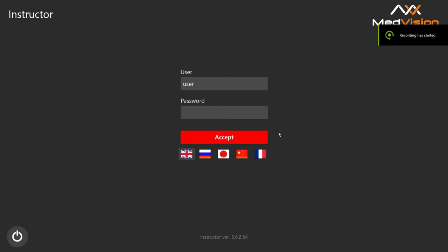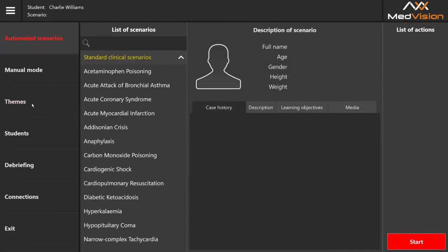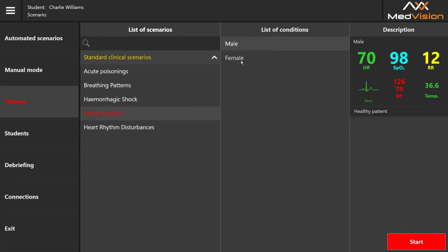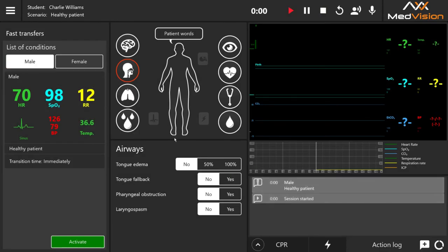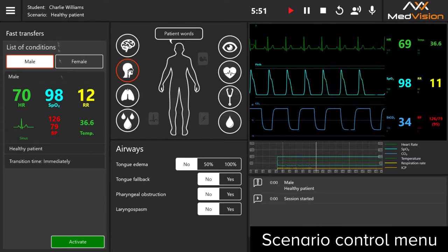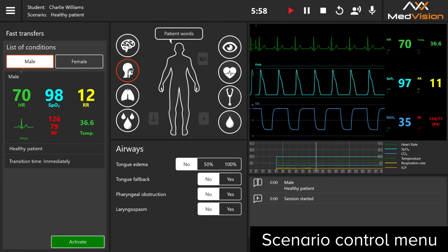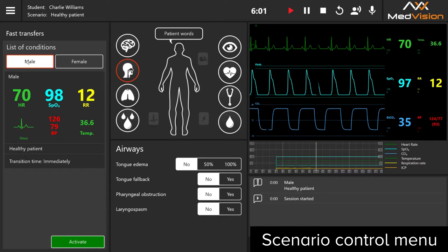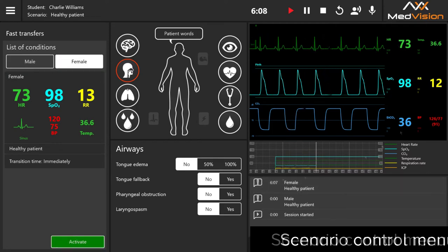Let's launch a healthy patient theme on Leonardo High Fidelity. Type in your username and password, press accept, select themes, select healthy patient, choose the preset, and press start. This offers you the option to change parameters before starting. After pressing start, you see the main scenario screen with the healthy patient launched, broken down into three sections.